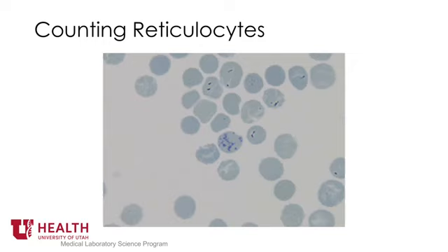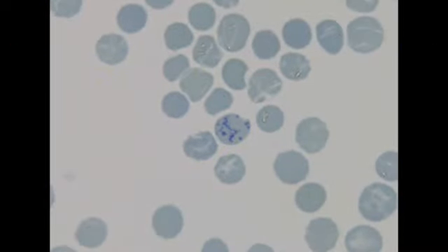Reticulated cells have dark bluish-green staining strands or granules inside of them. If you are unsure if the cells are reticulated, focus the objective up and down. Artifacts will become refractive, but the reticulated inclusions will go in and out of focus.